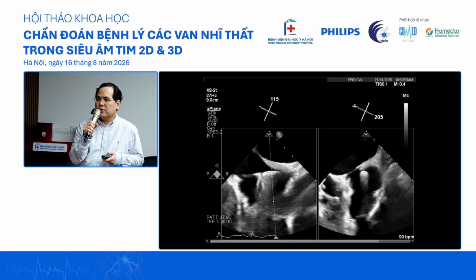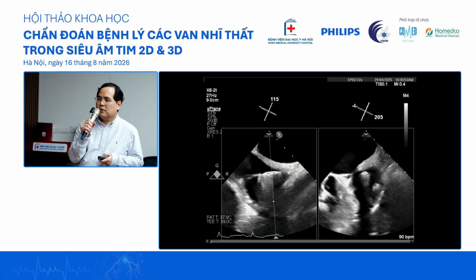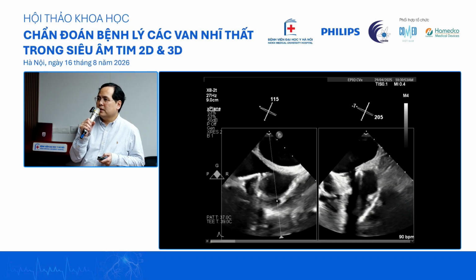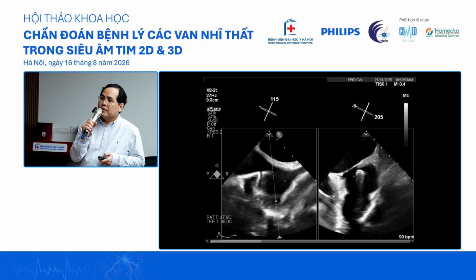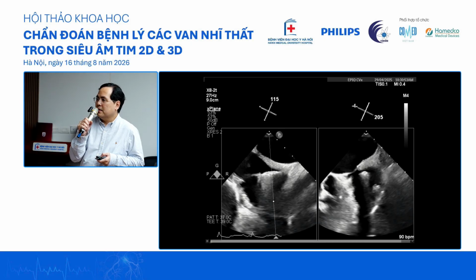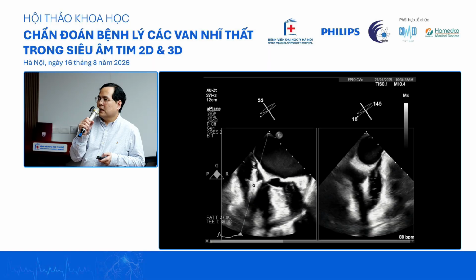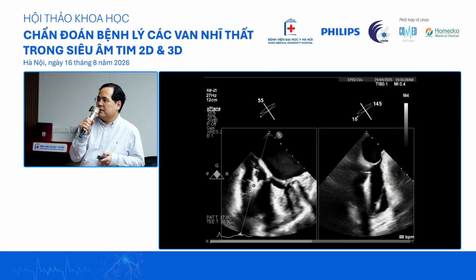Okay, so the good thing about TriClip is we don't need to do a transseptal puncture, so it saves a lot of time. We just confine to the right chamber. So we usually look at the clip arms alignment at the bicaval view. Okay, and then you can do an X-plane. You can see where the clip arm is. Then after that, you can see the clip is actually very well aligned between the leaflets.